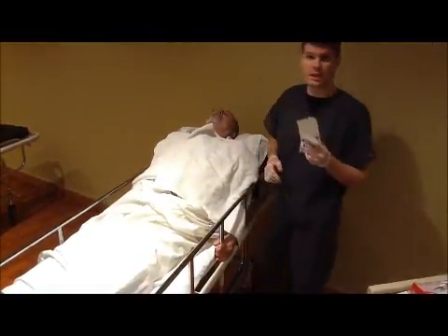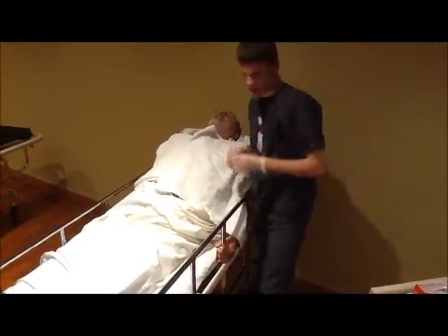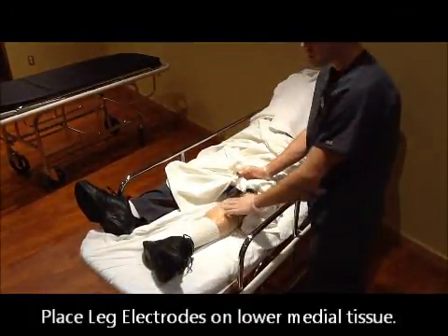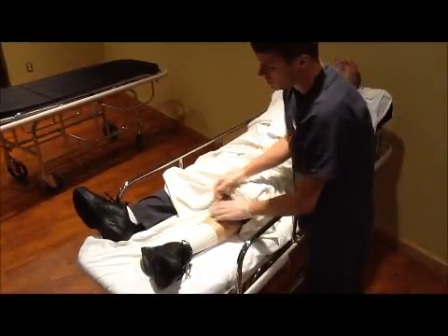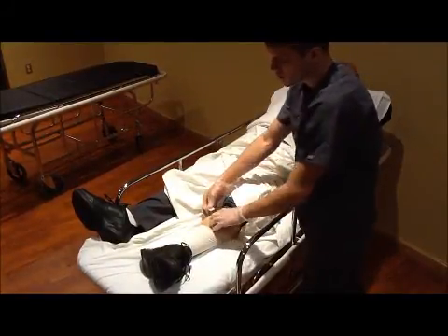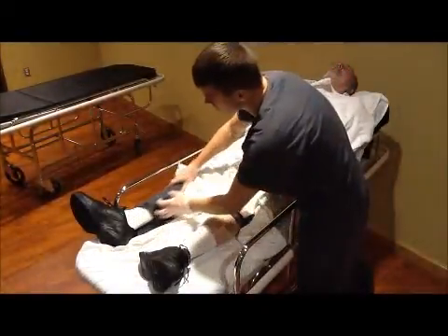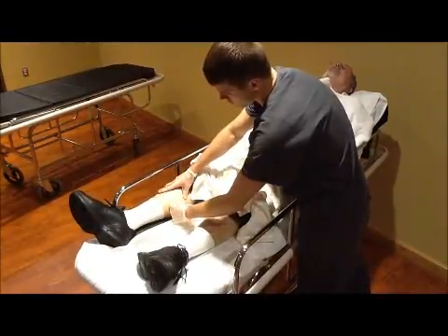We'll now place the last four electrodes, starting with the feet. They go on the medial side of the leg. You do not want to stick them on a bone, because bone is not a good conductor of electricity. Place one on each leg, both on the medial side.